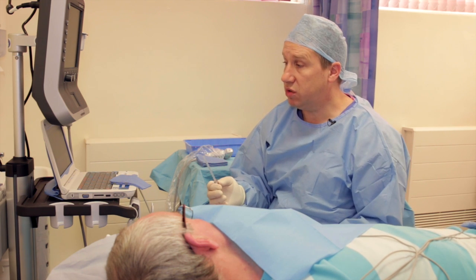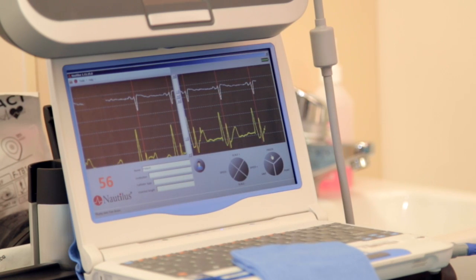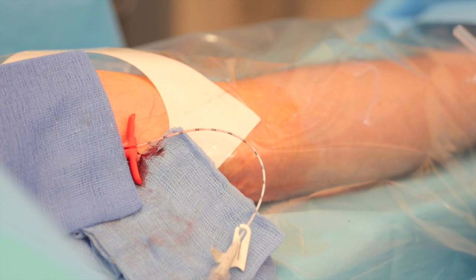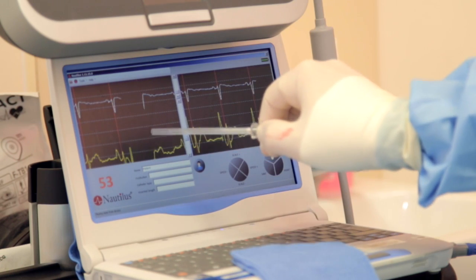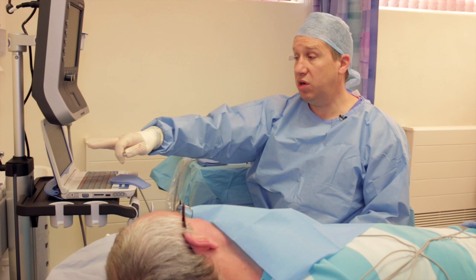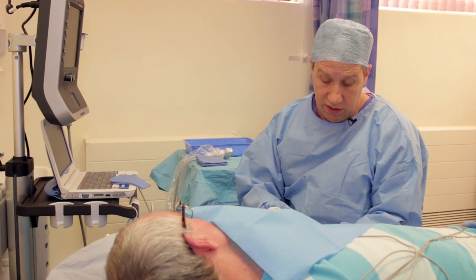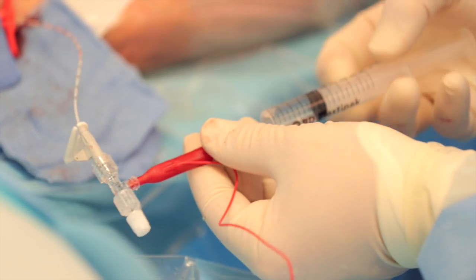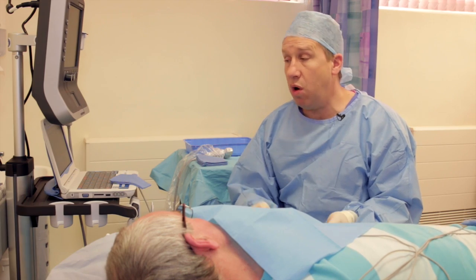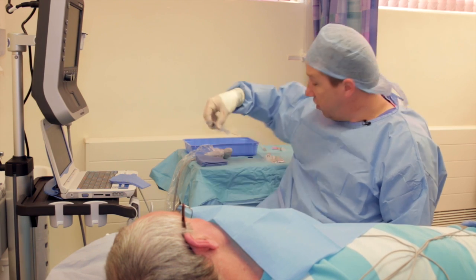Demonstrating P wave amplitude changes further. Pulling back more shows P wave amplitude decreasing significantly. If the ECG trace goes flat, it's likely because the column of saline has been lost. Reconnecting the syringe and giving a small flush regenerates the continuous saline column — this is one of the commonest reasons why the ECG trace is not ideal. After flushing, the small P waves are visible again.